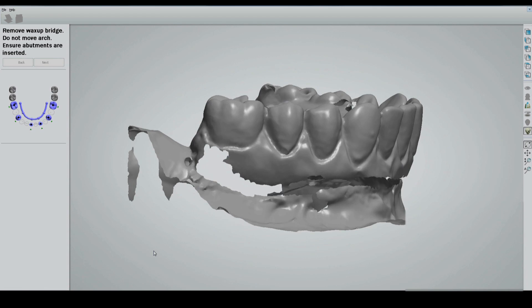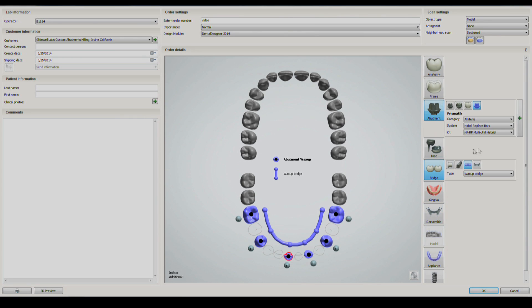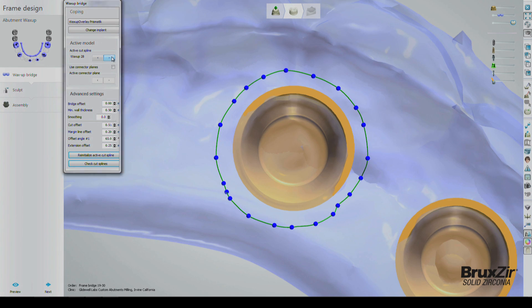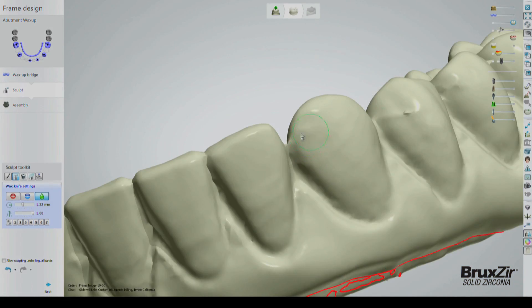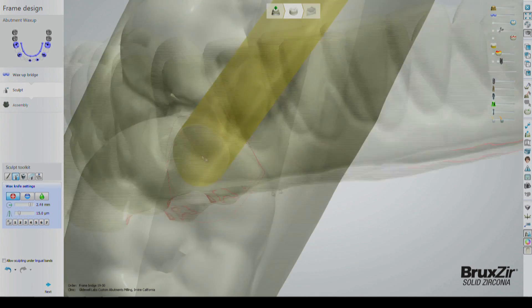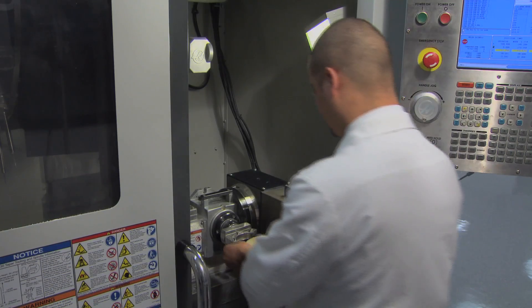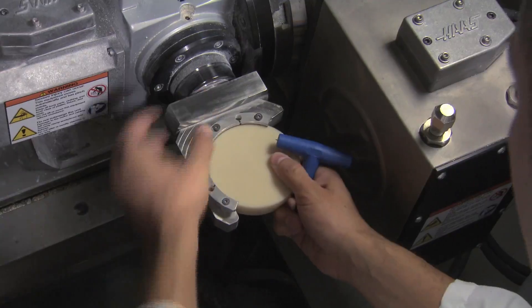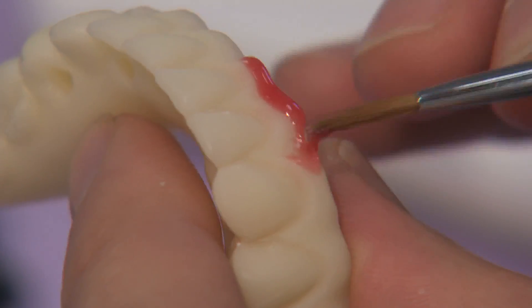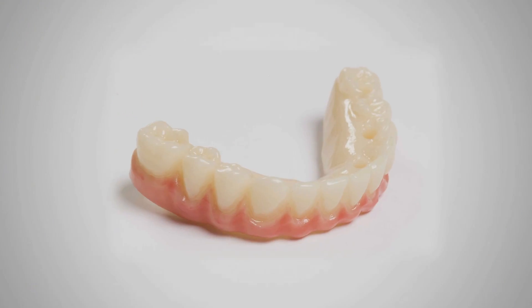Then the wax setup is scanned alone. The CAD-CAM dental software program 3Shape Dental Designer automatically aligns the scanning abutments with the soft tissue model and provides an accurate, distortion-free representation of the prosthesis and master model, including the position and angulation of the implants. From this information, a provisional implant prosthesis, which allows the patient to evaluate the proposed restoration prior to fabrication of the final prosthesis, is digitally designed. The provisional is then milled from polymethylmethacrylate, a biocompatible material that is easily adjusted to fine-tune occlusion. The milled provisional denture replicates the approved wax setup and is stained to function as a lifelike temporary restoration during the trial period.